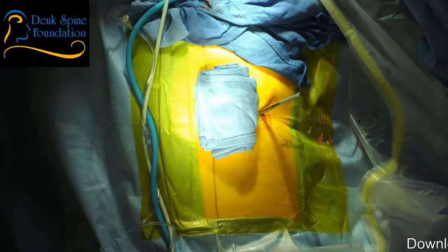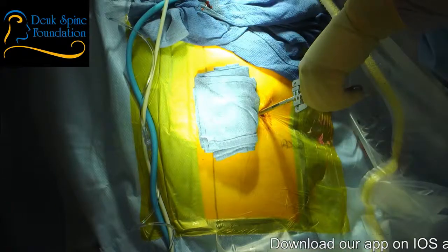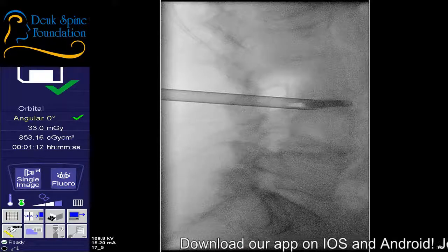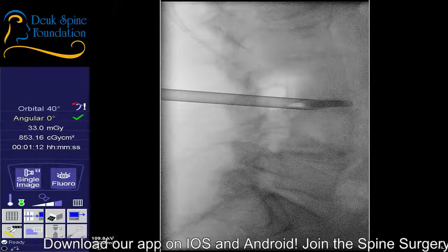Is that the latest? All right. Shot. Let's see where we are. Perfect. All right. Any questions from our audience? Let's get the fluoro out. This will be our last disc we're doing on this patient. We don't have anything else we're doing, right?